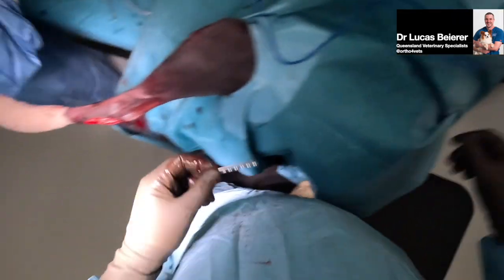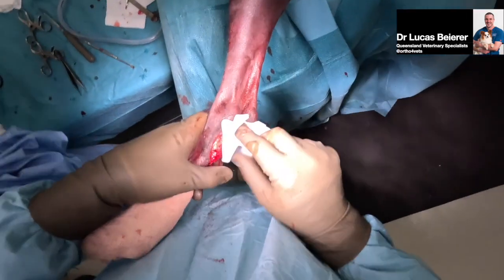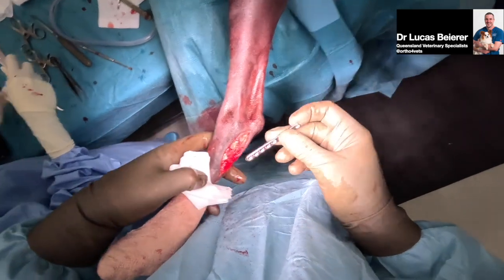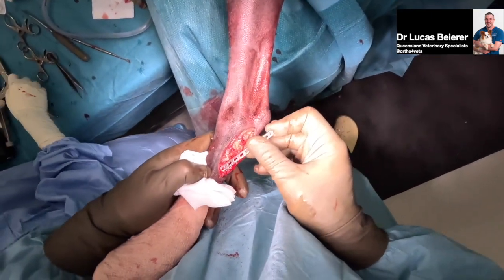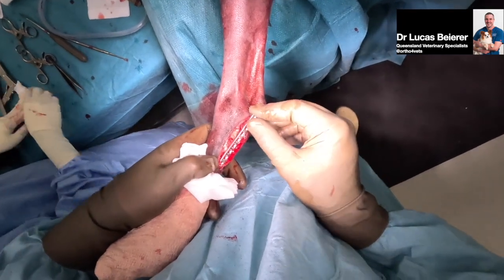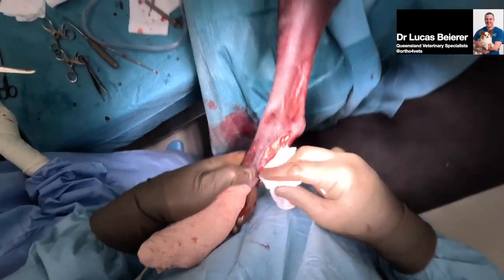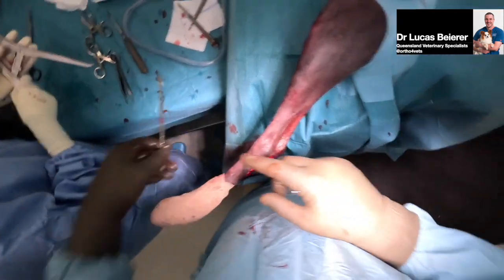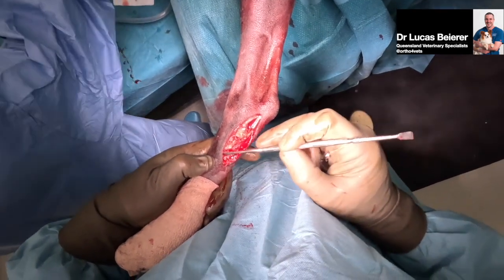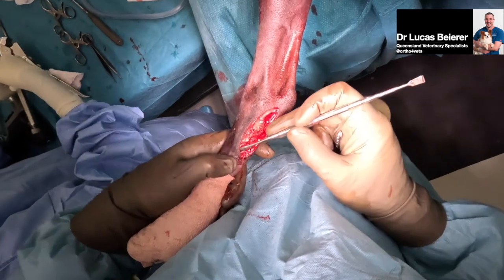You always warn that these plates are going to have to be removed, most likely? No, just that there's going to be wound challenges and potential for infection, but I wouldn't default remove the plate. Yeah, okay. Jason was saying yesterday he thinks that half the greyhounds need the implants out, doesn't he? But I don't know, I don't think we know. I think that becomes a self-fulfilling prophecy if you recommend implant removal on every other one, that if they do well, then they did well because you took the implants out, but maybe they were just going to do well.